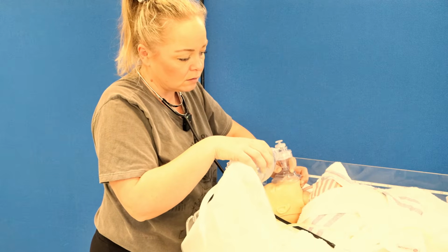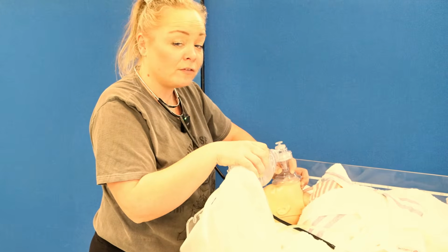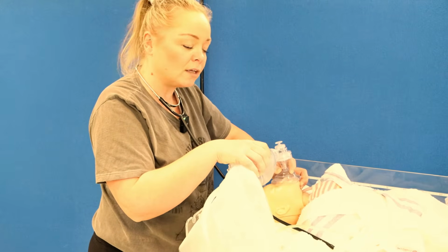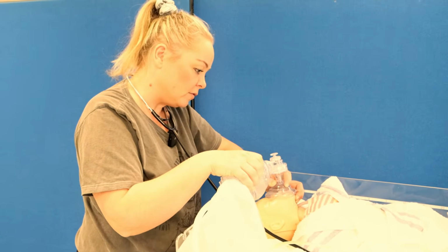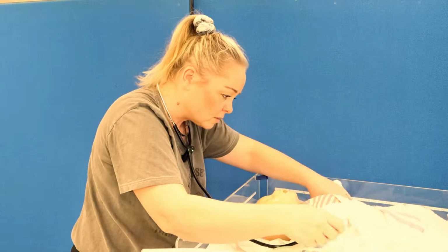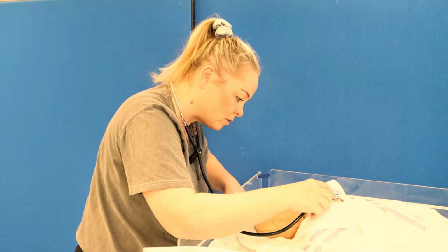So I'm doing 15 ventilation breaths, which should take 30 seconds. 1 second on and 1 second off at this point. Colour is still blue, they're still floppy, and their heart rate is still slow.